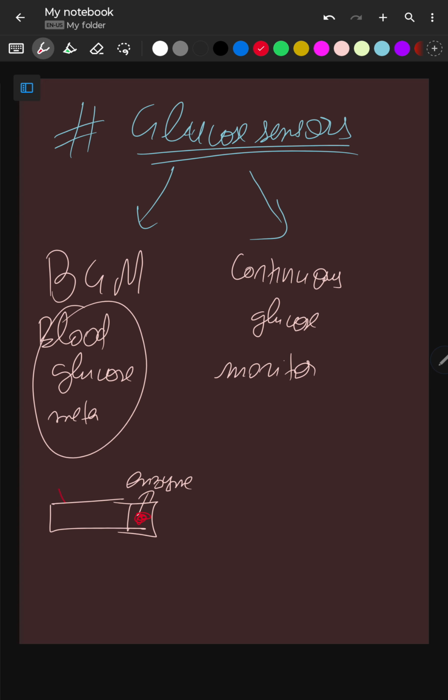That current is sent to the digital meter here. That will convert the current into digital glucose readings, which we can monitor. It comes in a fraction of a second.